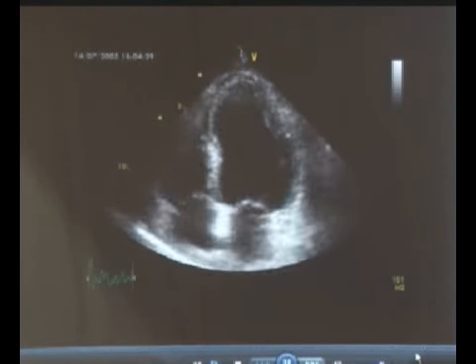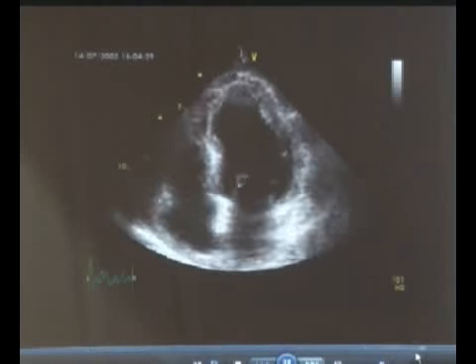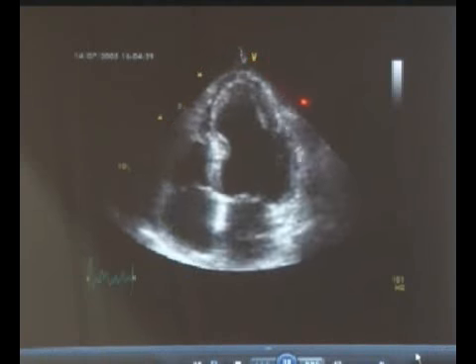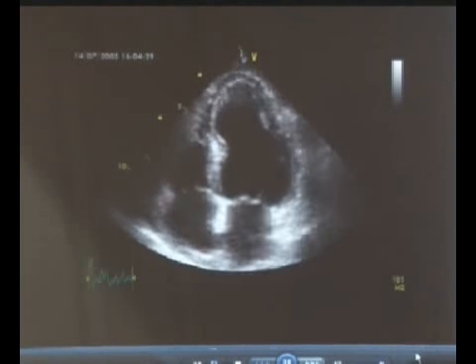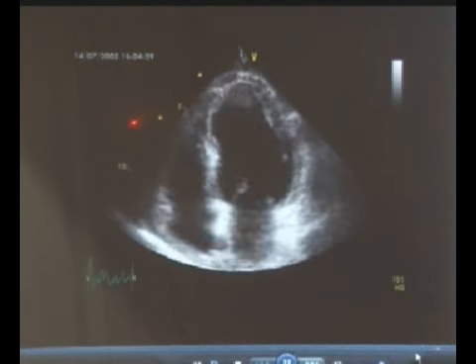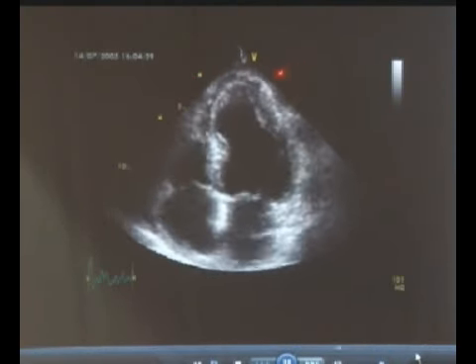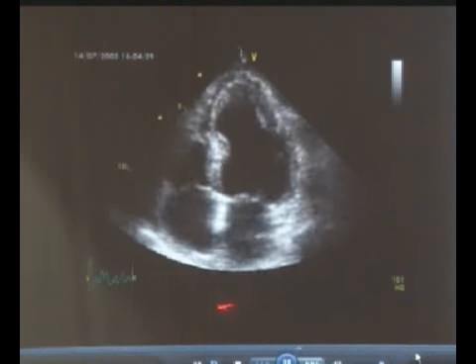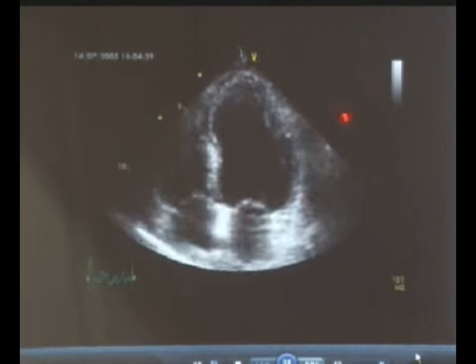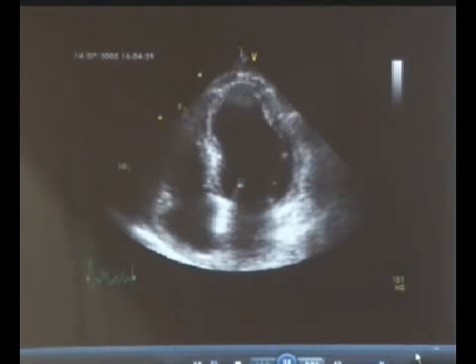wall thickening abnormality. You have been making good views, I am not saying no, but today you should make a perfect view where the apex should be in this triangle, and machines have this focus. Look over here, the focus is present over here. In your system the focus is over here. I have got 2 focus, you can have 2 focus over here. You are not concerned with these images, let them be blurred or whatever, we are really not concerned. We are really concerned about this LV when we are focusing on wall thickening abnormalities. Are we clear? Okay.